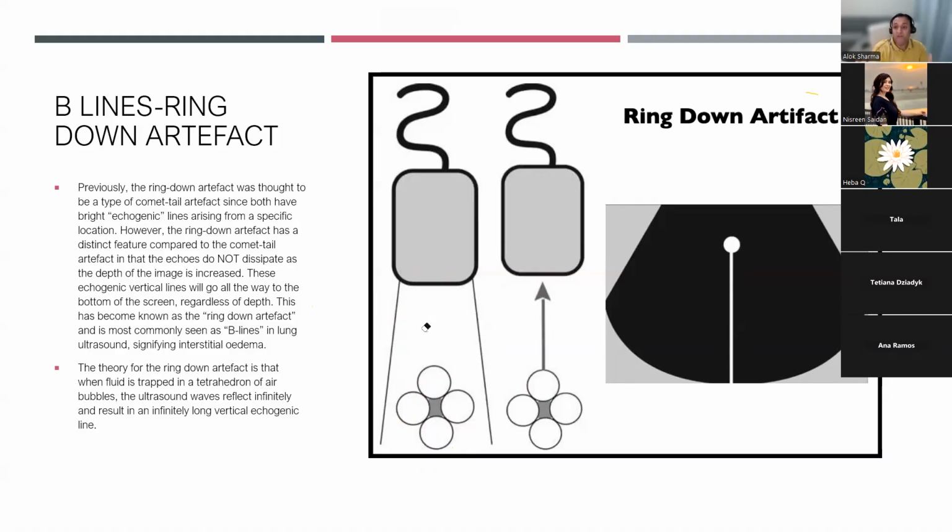If you get fluid in the alveoli and fluid in the interstitial space, then there's actually nowhere to go. The fluid, like I said, will basically mean that sound waves penetrate through a uniformly dense fluid, which produces uniform reflection. You get what we call white lung or alveolar interstitial edema. And I will cover some of that tomorrow.